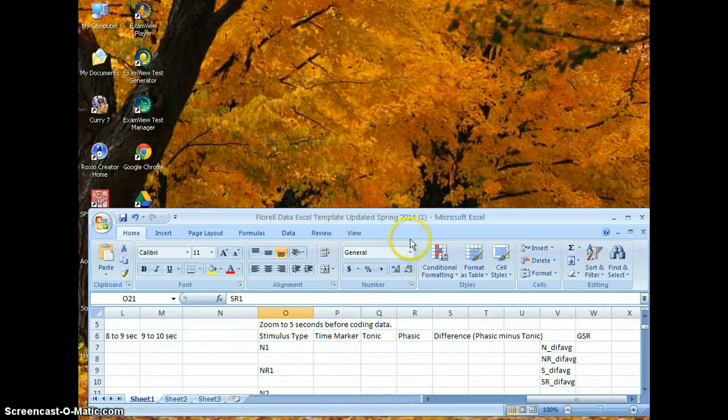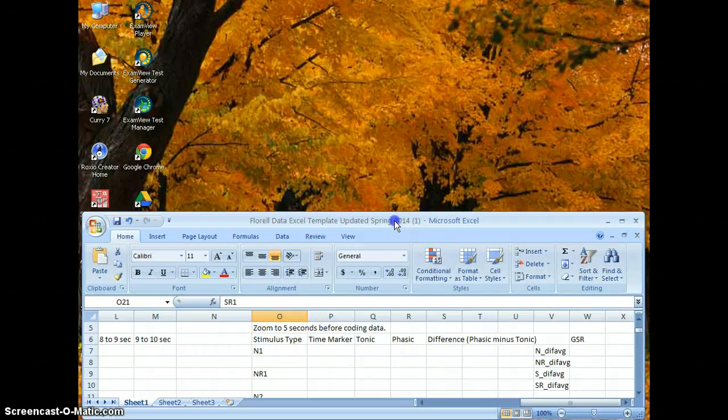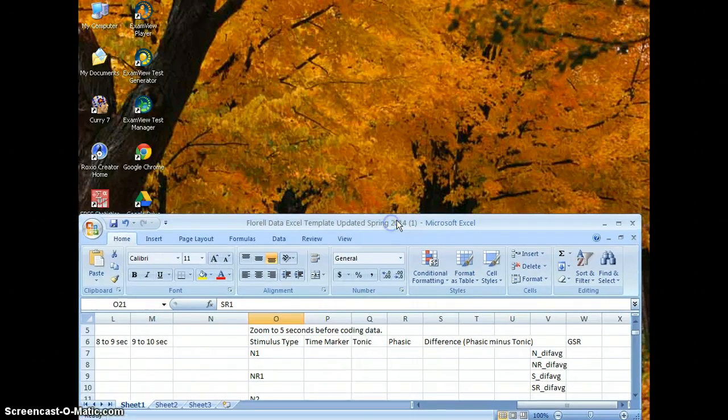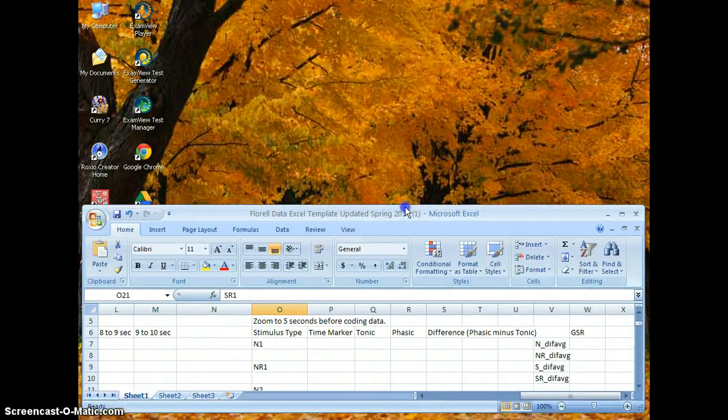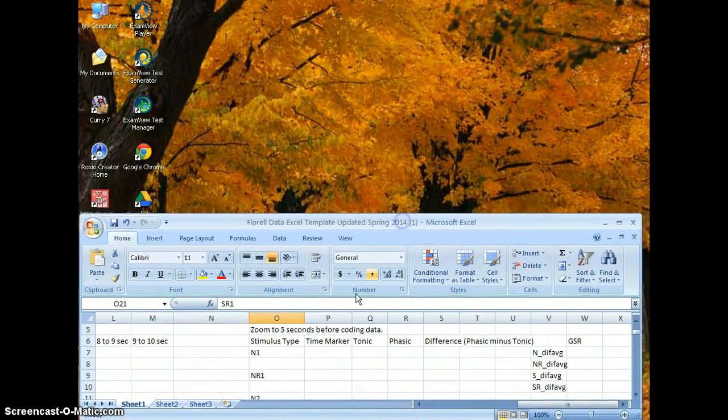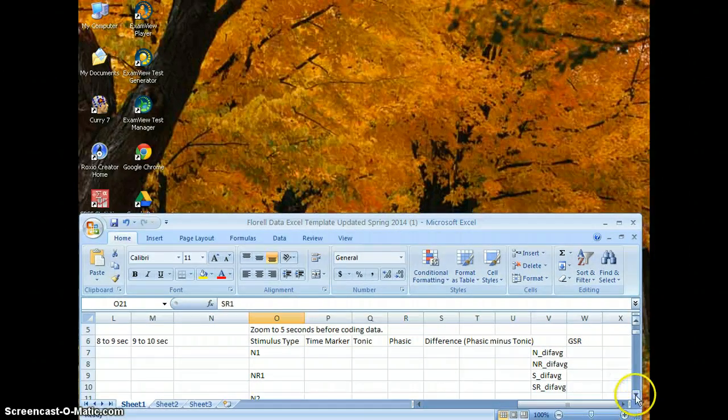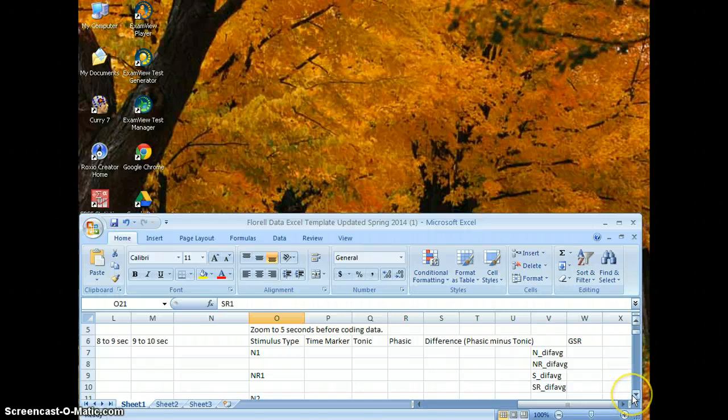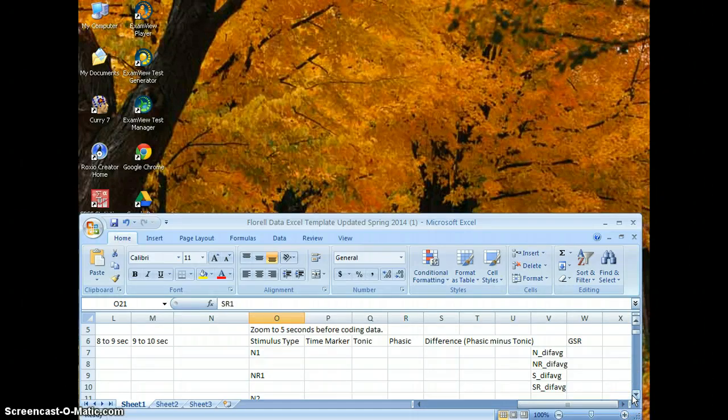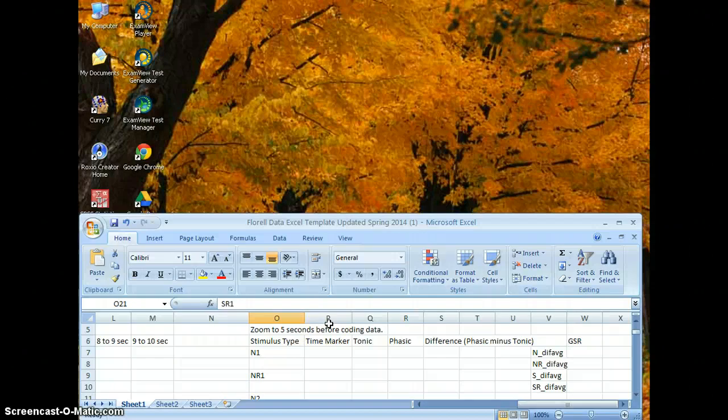Okay, so now we're going to learn how to code and analyze GSR data. In order to do that, you'll need your same Excel sheet. Now normally when you're really analyzing GSR, this Excel sheet will already be filled completely in because the heart rate will have already been analyzed.